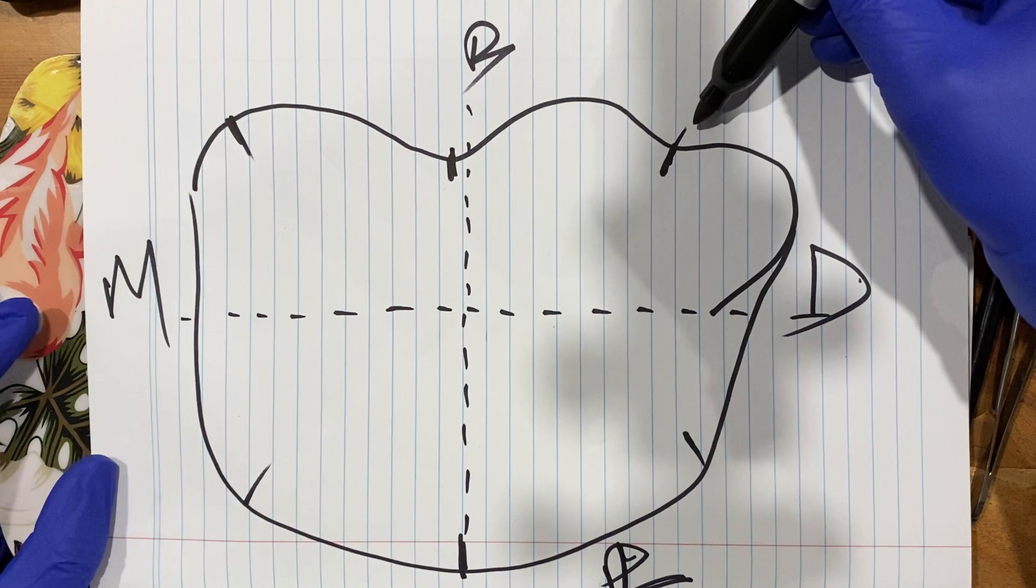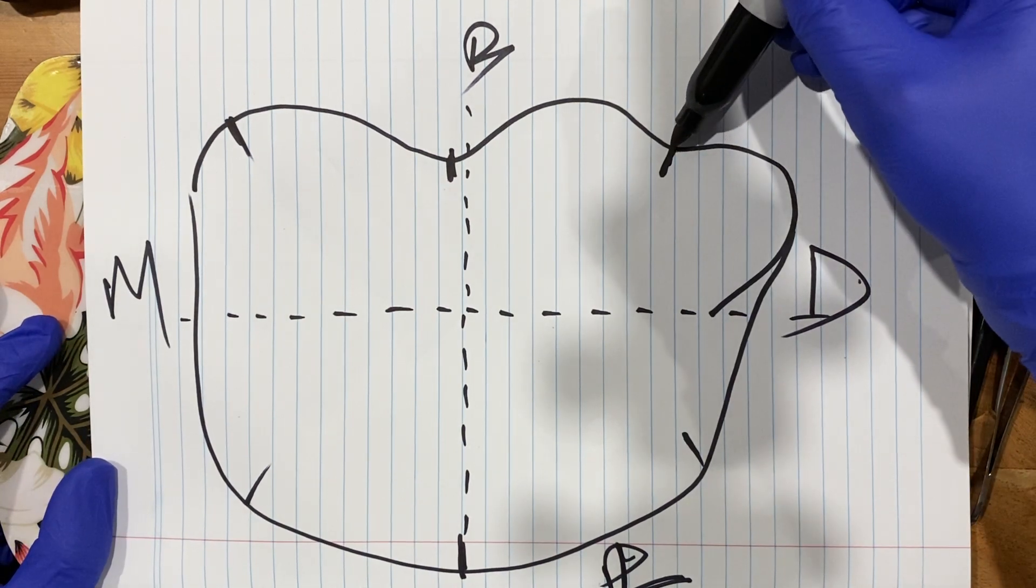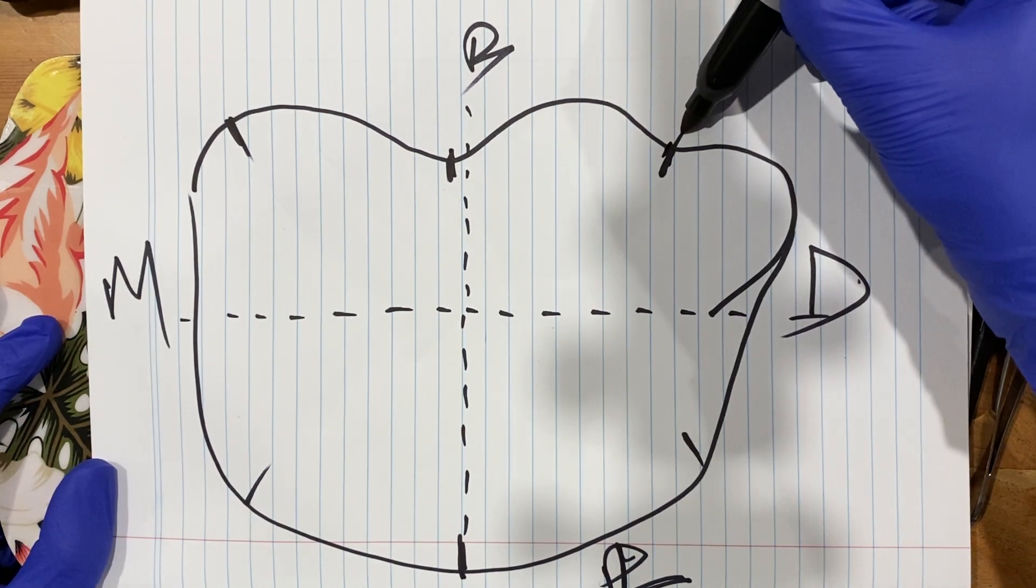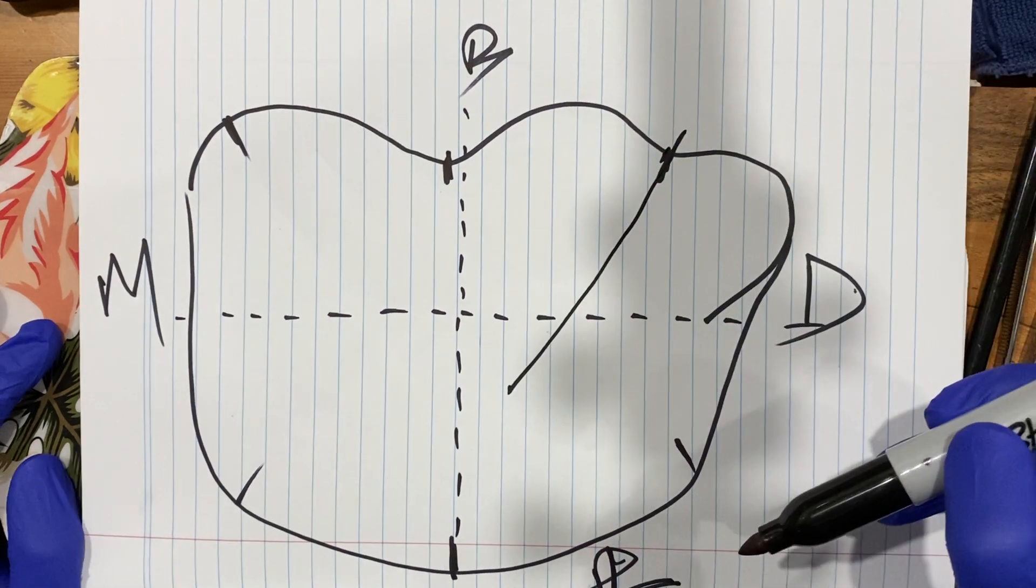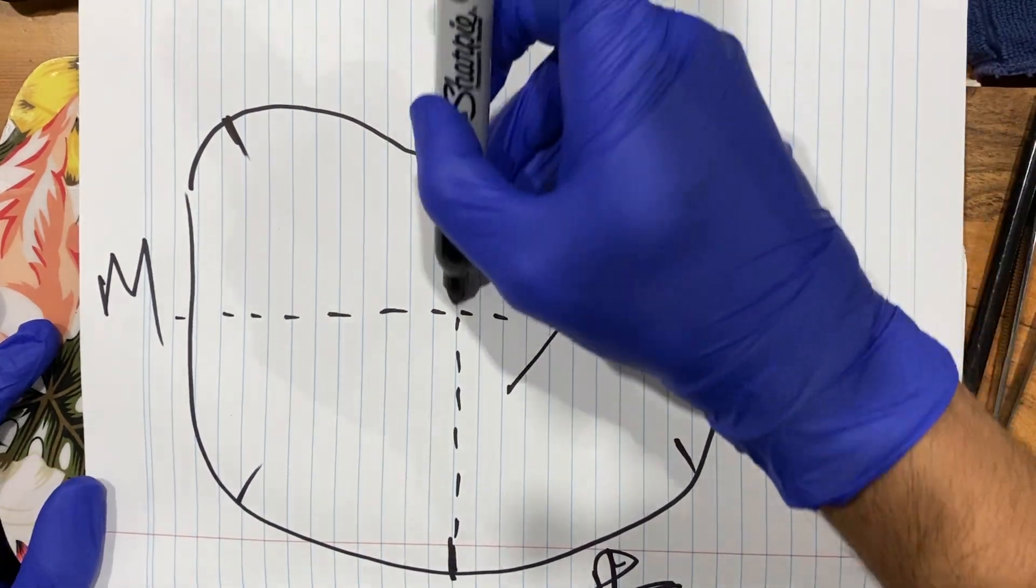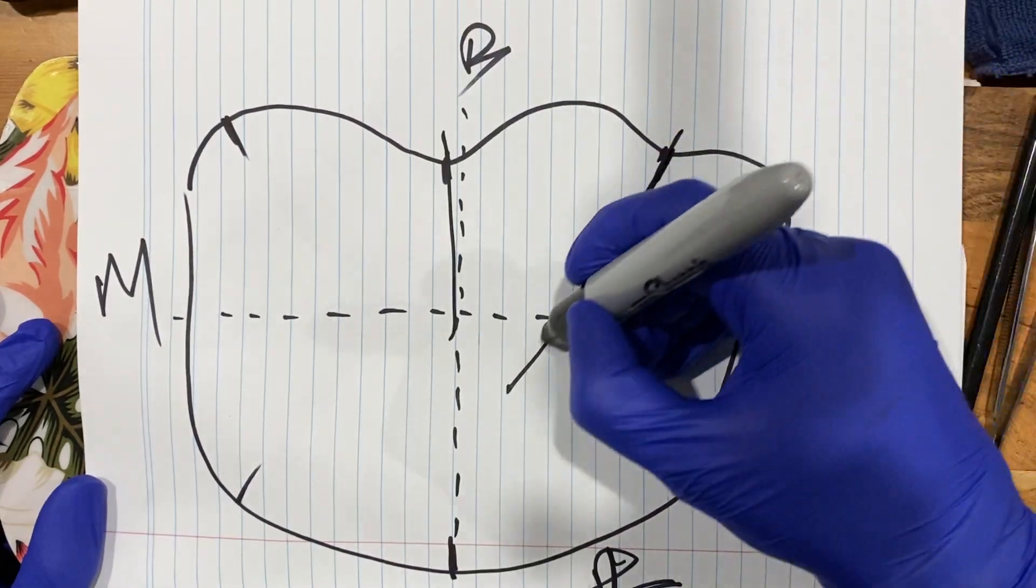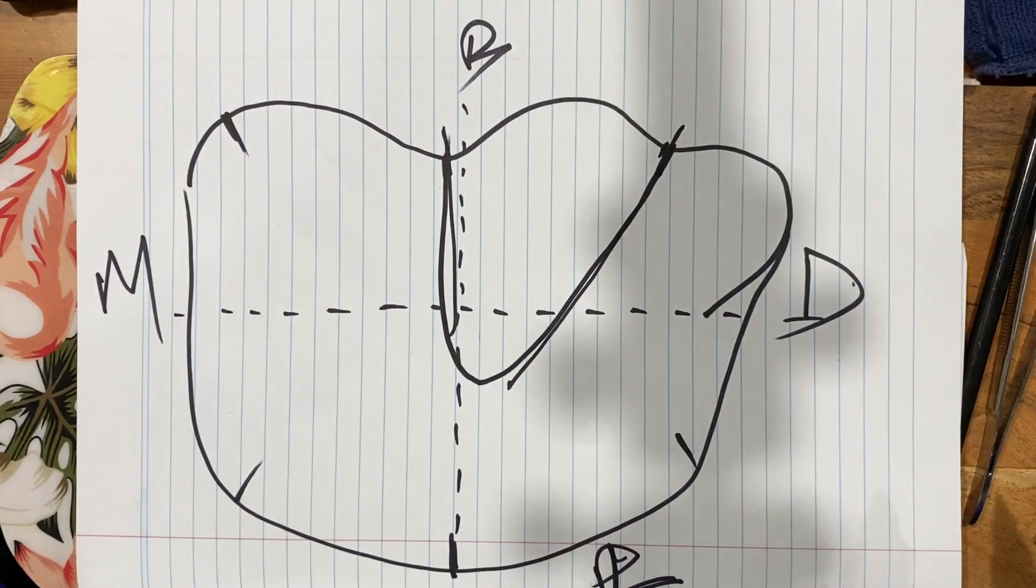So I put my, literally I put my amalgam carver here and follow it through where it's taking me. Follow it through where it's taking me. Follow it through where it's taking. If you follow it through, you automatically see it take you like that and forms an A.